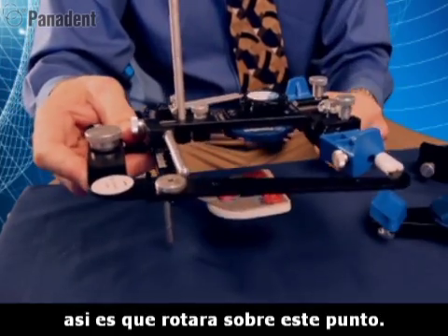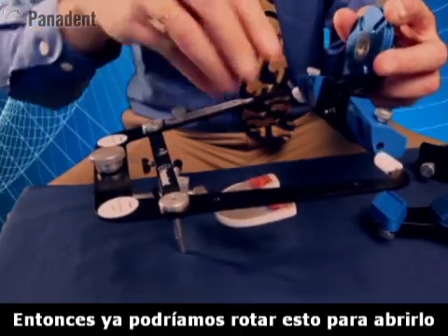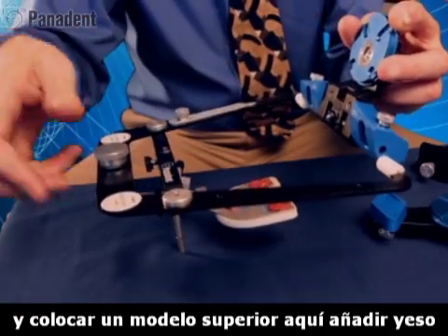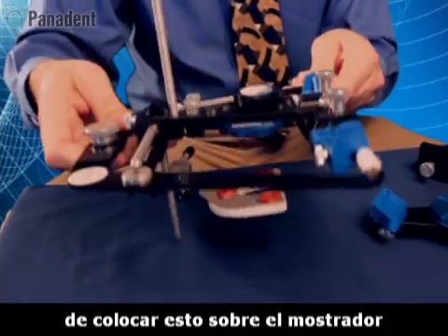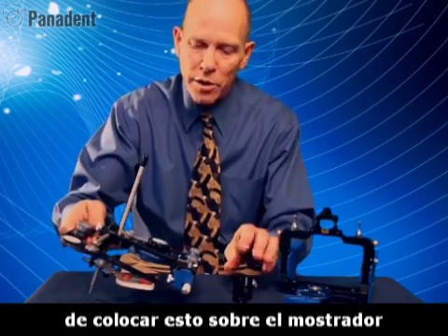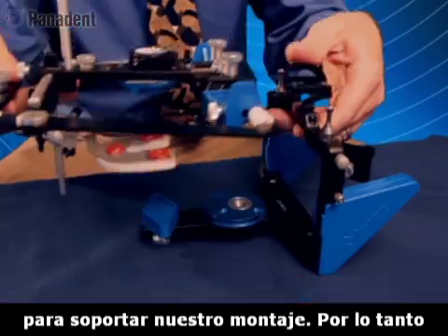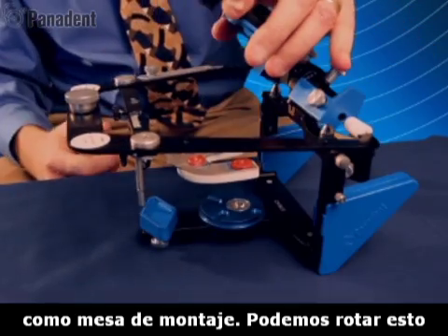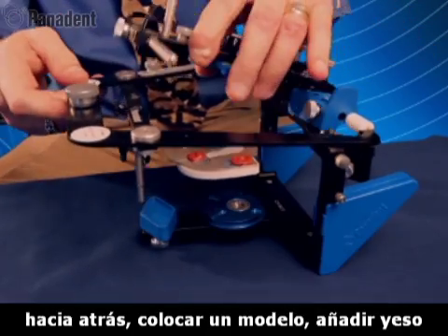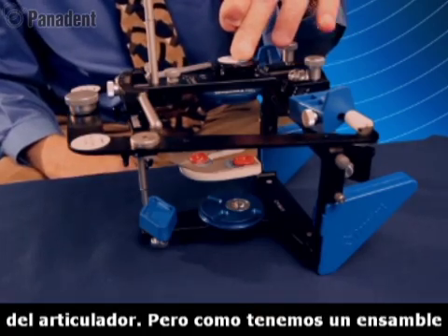So it would rotate around that point. We could actually rotate this open, set a model in here, add some plaster and make a connection. But it's very awkward to set this on a countertop, so we like to have a convenient mounting stand. I'm going to use the articulator lower frame as a mounting stand. Now we can rotate this back, put in a model, add some plaster and make a connection to the upper frame of the articulator.